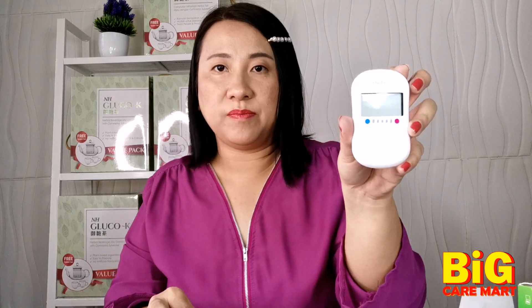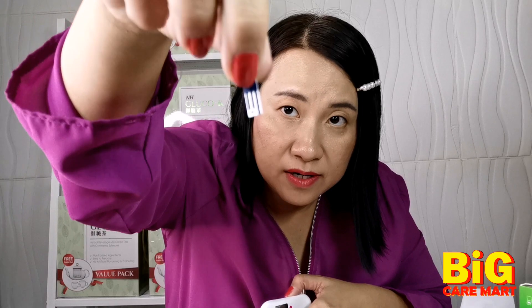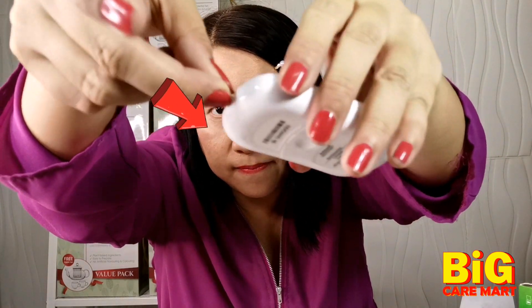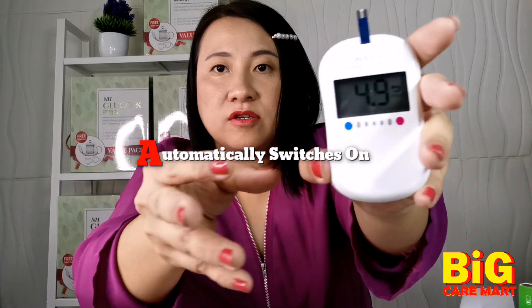Get your meter and the strips ready. Remember, the One Touch Simple Select only fits One Touch Simple Select strips — don't buy another brand because it won't fit. Take one out and always cap it back to keep it properly. You poke the strip into the hole here and you don't need to press anything — it's auto on.